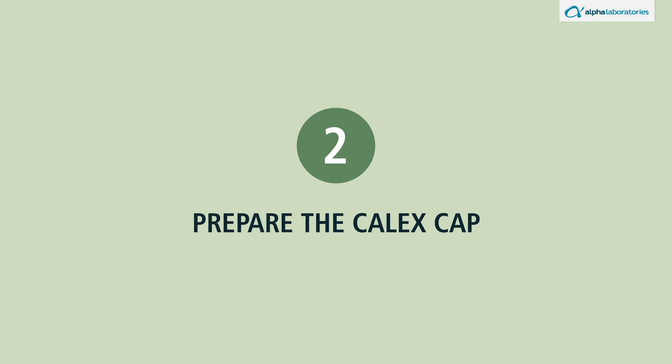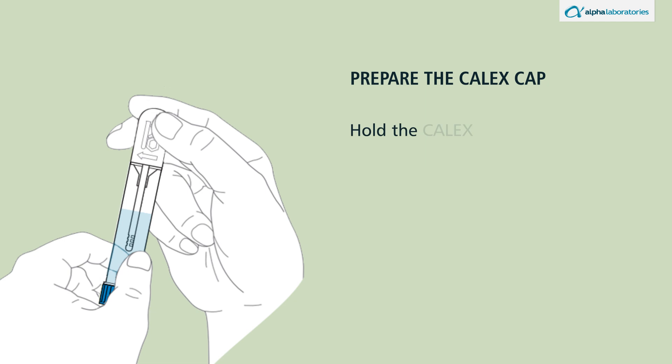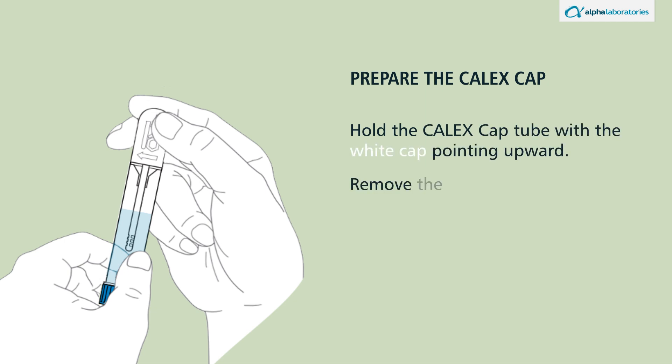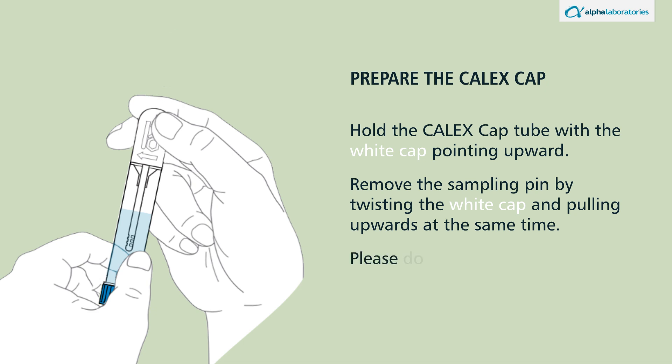Prepare the calyx cap. Hold the calyx cap tube with the white cap pointing upward. Remove the sampling pin by twisting the white cap and pulling upwards at the same time. Please do not twist or remove the blue cap.